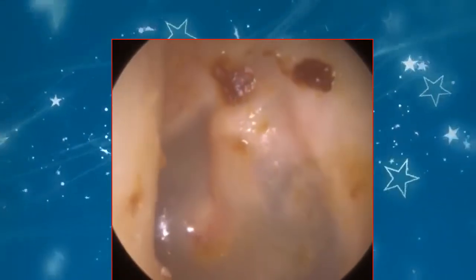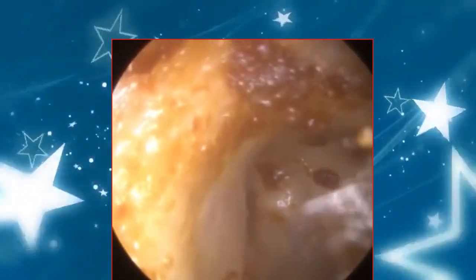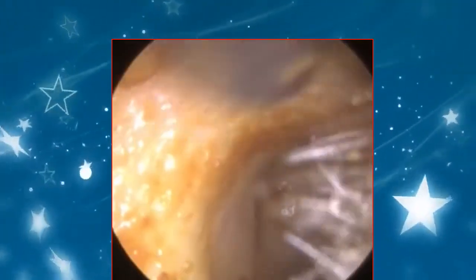So I've got the blockage out, just a bit of wet wax here. This is considered a spot of wax near the top of the eardrum. We're going to leave that because it's not going to improve the patient's symptoms. It is a bit of a wet, mushy wax anyway as well, so it's a bit harder to suction. And given it's not going to improve the patient's symptoms, there's no need to remove that. So a bit of wax is good for us. And see, nice healthy eardrum.